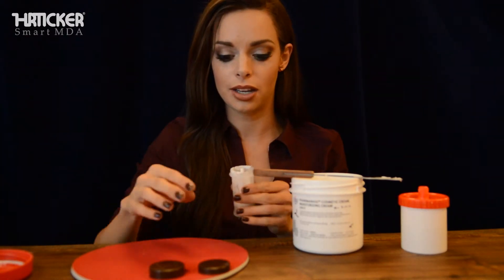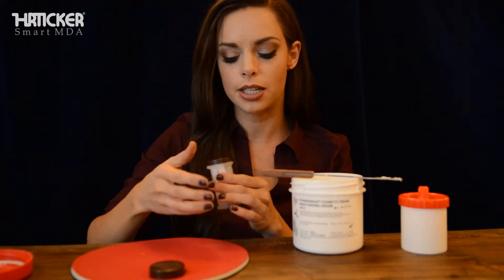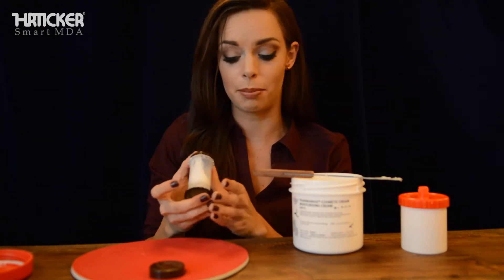Once you have as much medication as you need, go ahead and take the dispenser cap. You'll feel it kind of sit into place, and then press it until you hear it really snap in.